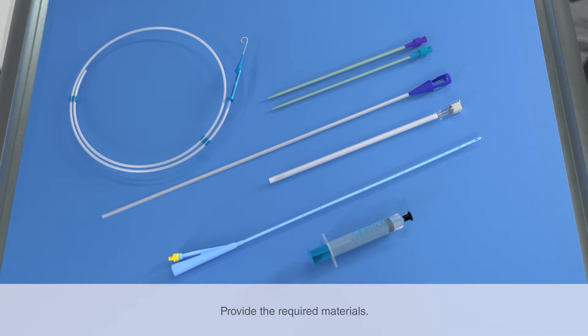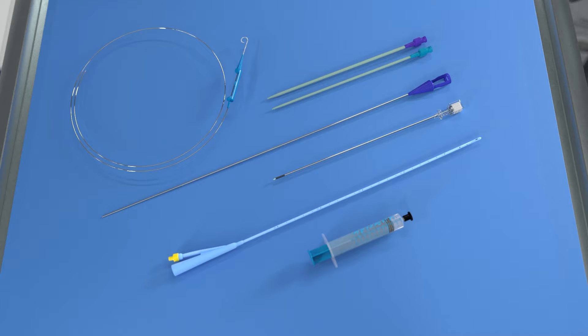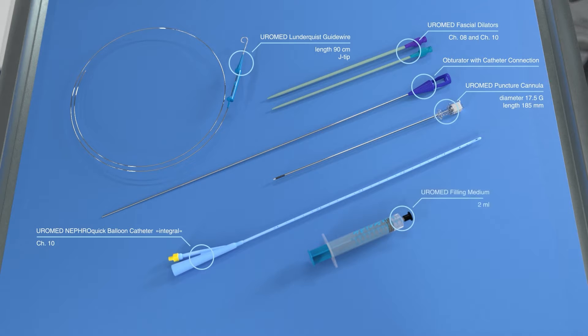Keep the blister pack with the set components at hand. These include the Euromed puncture cannula, the Euromed Lundqvist guide wire, two Euromed fascial dilators of different sizes, the Euromed NephroQuick balloon catheter, the obturator with catheter connection, and the Euromed filling medium.